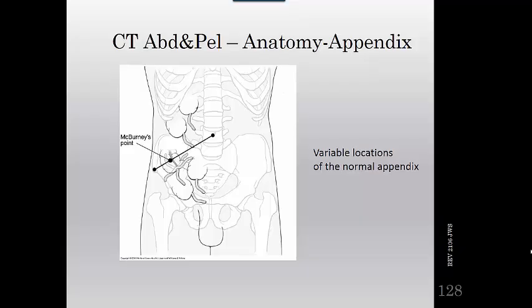But scanning for appendicitis protocols has dramatically reduced the false positives that they were getting, and saved a lot of people from going to surgery. It's cut down dramatically on the exploratory surgery, trying to determine whether it's really appendicitis or not. So it's been a very valuable tool for the patients.